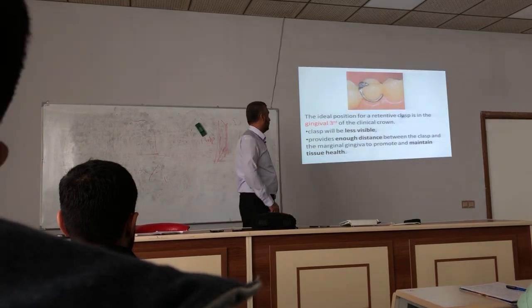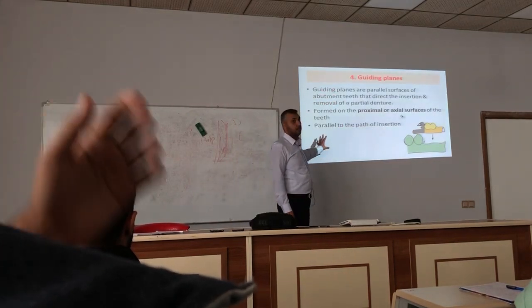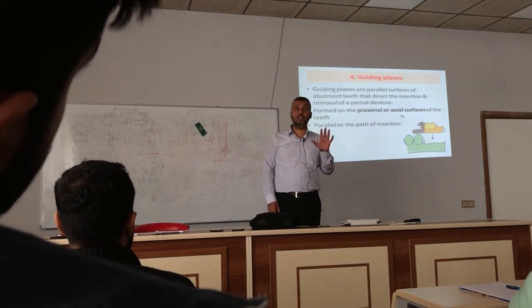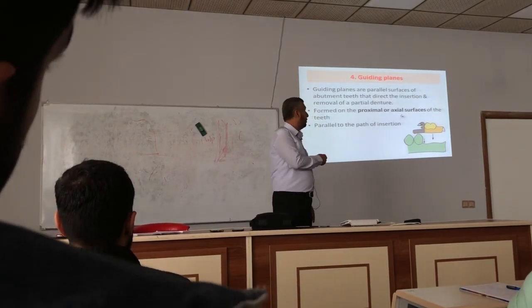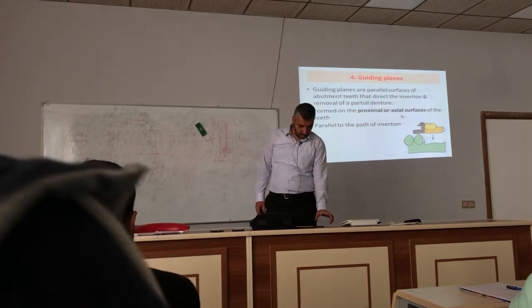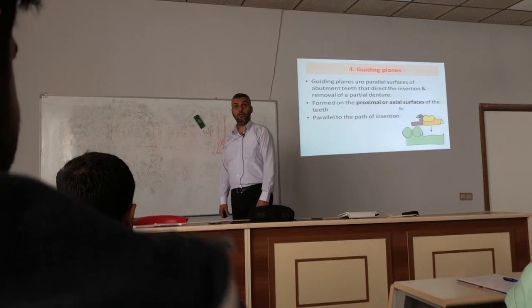Okay. We finished the aesthetic part related to surveying. Now we talk about the guiding plane. What was the guiding plane? As we said, what was the guiding plane?